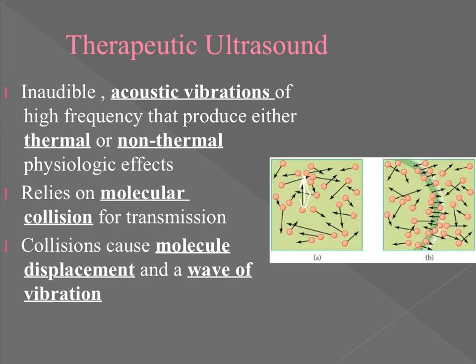And I think most of us in this class are aware of what ultrasound can do thermally, but one of the things that I've started to learn a lot more about as I dive deeper into the literature is about the non-thermal effects. And so I'm a big fan of therapeutic ultrasound for its non-thermal effects as well.